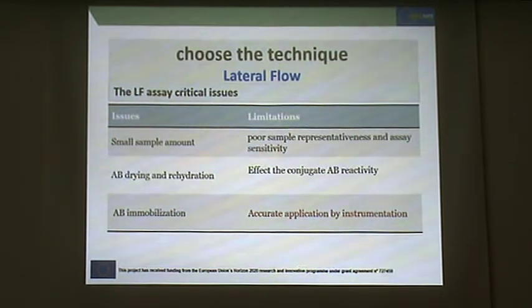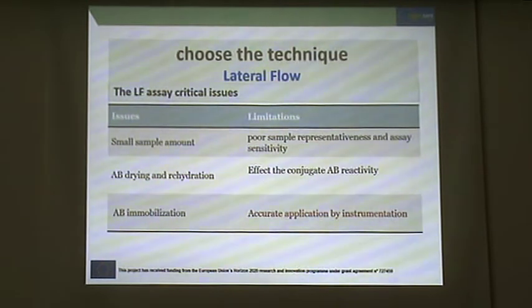One is the sensitivity of the assay. We cannot load the sample with high volume preparation. We have to load the device with a small amount of the sample.